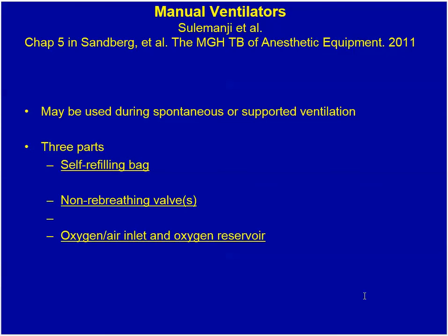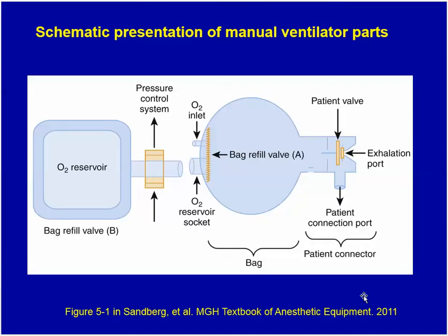There are basically three components of these manual ventilators. There's a self-filling refilling bag, the non-rebreathing valves, and the air/oxygen reservoir. This is a schematic presentation of these manual ventilators showing these three components. This is a self-inflating bag, which you can squeeze to ventilate the patient, or the patient can inspire gases out of.